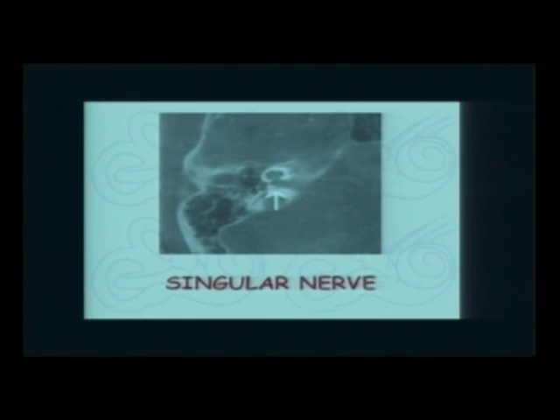The CT scan can be so accurate that you can see the cochlear nerve coming out from the base of the cochlea, the inferior vestibular nerve coming out at the level of the posterior canal, and you see this very small dark line here. This is the singular nerve, which is the special nerve for the posterior semicircular canal. There used to be an operation in the past that we stopped doing, in which we destroyed this nerve in benign paroxysmal positional vertigo. It was called the Gacek operation.